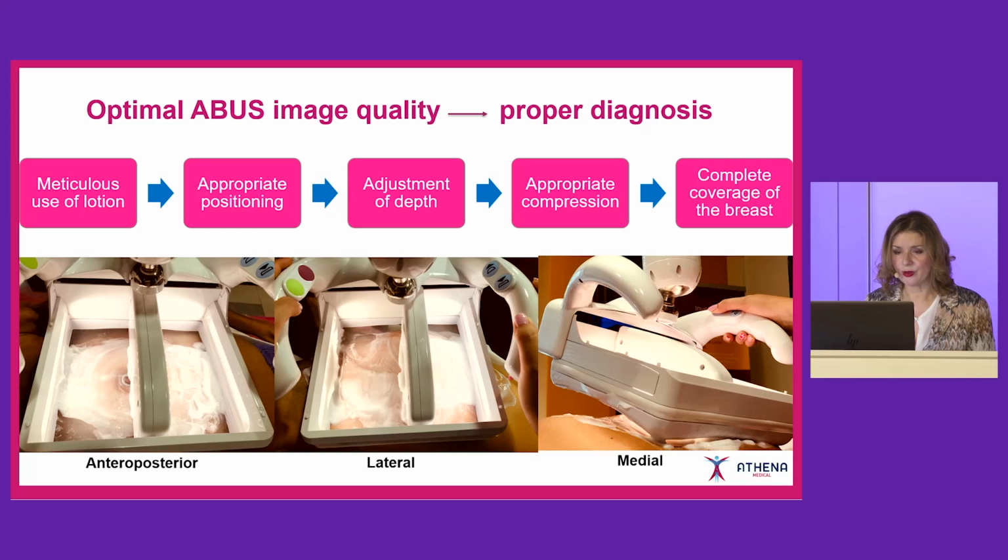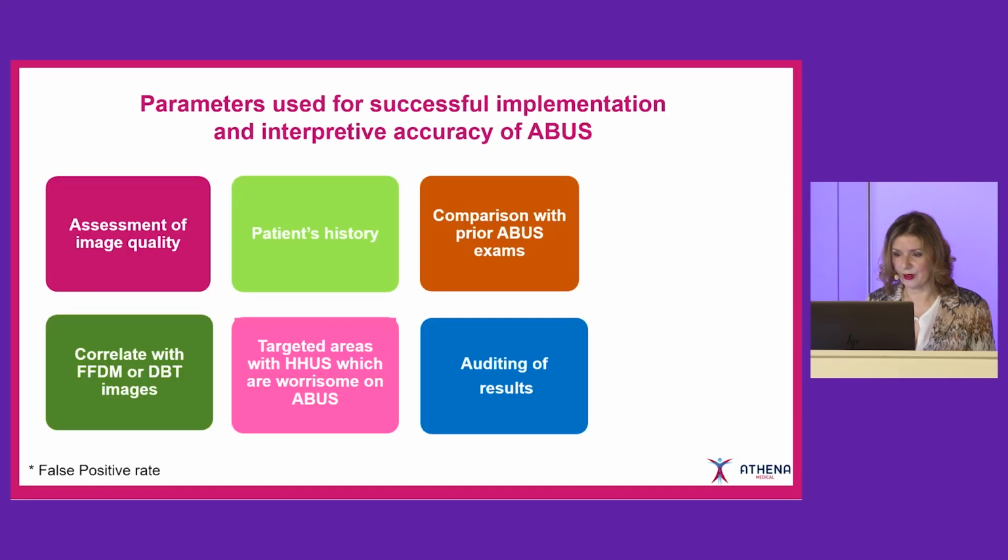In order to achieve great results, it is reasonable, as with every other imaging modality, that optimal image quality is necessary. Therefore, meticulous use of lotion is important, appropriate positioning, adjustment of depth, appropriate compression, and also we need complete coverage of the breast.